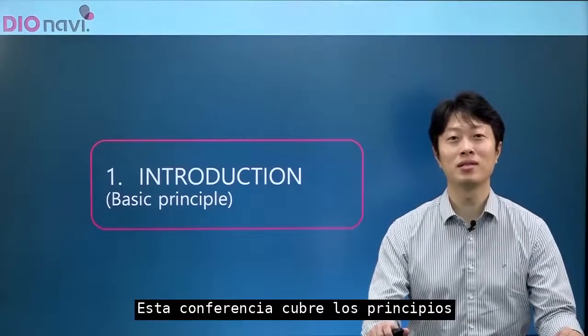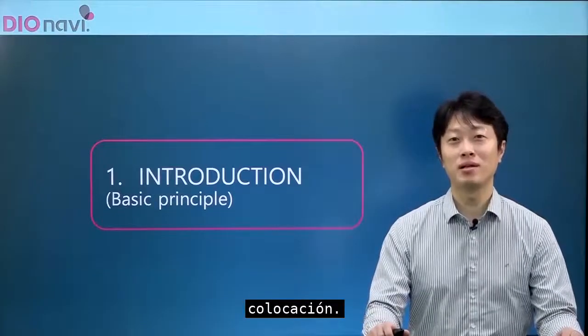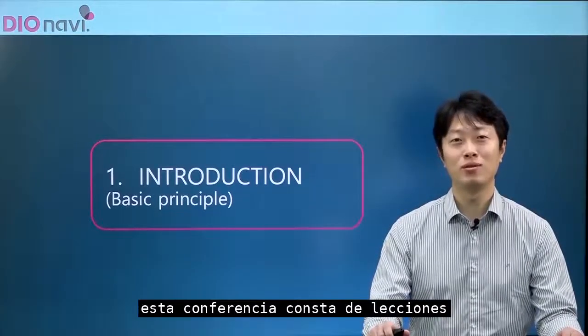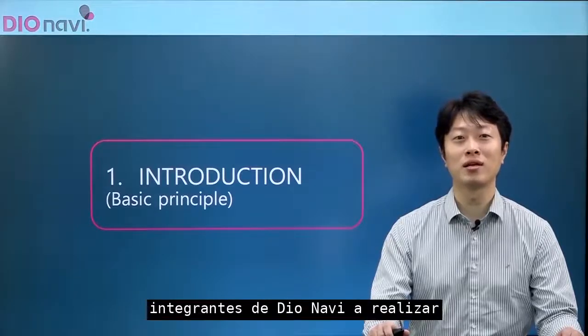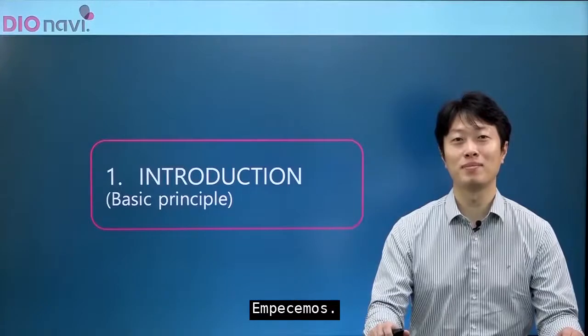This lecture covers the basic principles of DIOnavi and the basic placement method. This lecture consists of practical lessons to help those new to DIOnavi to perform implant surgeries immediately. Let's get started.